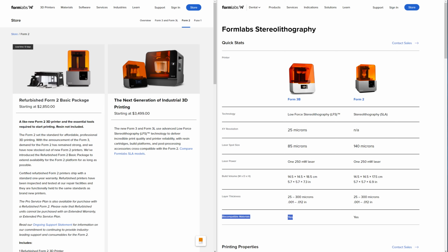Obviously, there's no studies been done, but my presumption is that it's not going to make any clinical difference. It will be more expensive. Not only is the printer itself about $1,000 more expensive, but also its parts. So this tank that it will be using will be more expensive than this basic tank that comes with Form 2. So that's my insight on this.